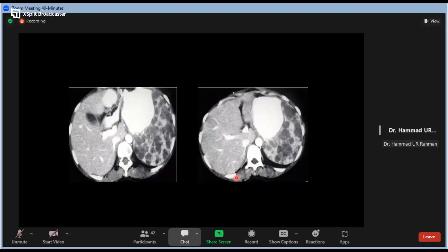It usually presents as multiple lesions within the spleen, and they enhance very late. This can be in your differential, but common things first. Lymphoproliferative disease should come in on top of your differential list, because the spleen is enlarged, and whenever you see these hypoattenuating lesions, you always need to look at other areas for lymph nodal enlargement and the history of the patient. So I am showing you this image and this slide so that this should be in your mind at least.